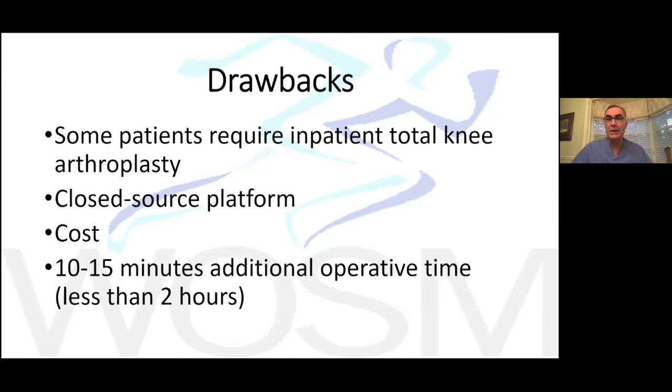So I'm dovetailing into the next bullet point, which is cost. These robots cost anywhere from $500,000 to $1 million. I think that price will come down. But right now, as this is really just past startup phase, the manufacturers are requiring that there be a payment for the actual computer-driven robot itself. I think there'll be downward price pressure there, but that is a barrier to entry for lots of different situations, whether it's a practice or a hospital system. These things have to be budgeted for.